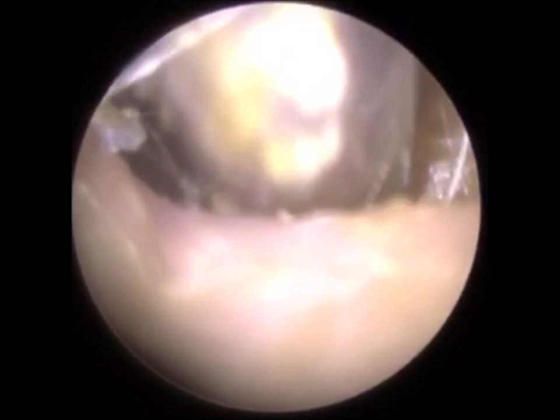I mean, it was quite plausible at this stage just to end the procedure because the client's symptoms more or less had resolved. You can see there's hardly any compression now because the rest of the ear canal is clear, it's open. But it's so important to remove this, I felt. He's not had this mastoid cleaned out for, I think, 17 years.